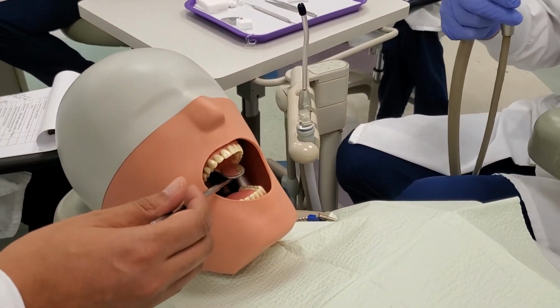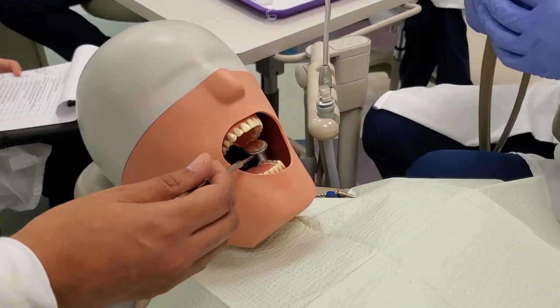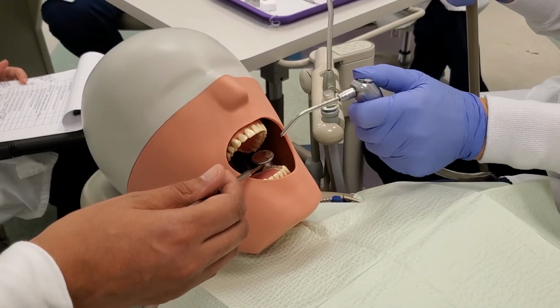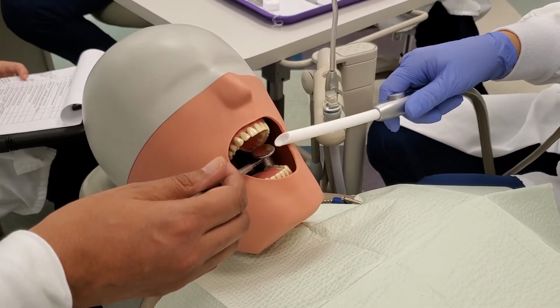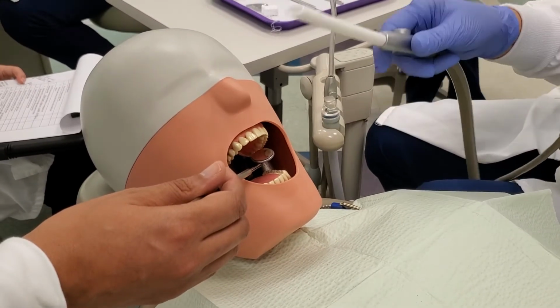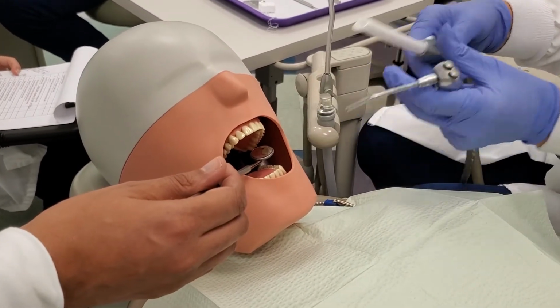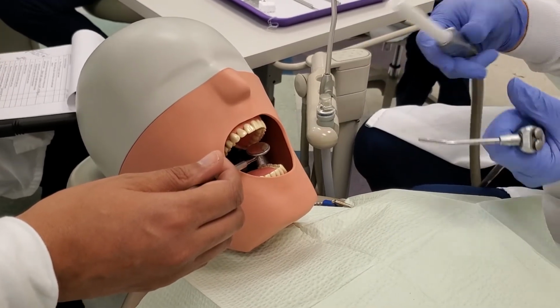So if we're working on tooth number 8, on the lingual of tooth number 8, the patient's breathing, you're going to fog up the mirror, so you're going to have to keep that mirror clean. This is your indirect vision right now, so you have to keep that mirror as clean as possible, because that's the only way that doctor can see that lingual aspect of that tooth. So if they're prepping the tooth, then you have debris on the mirror, you have water on the mirror from the handpiece and everything, so you're going to have to keep that mirror clean so he can see what he's doing.